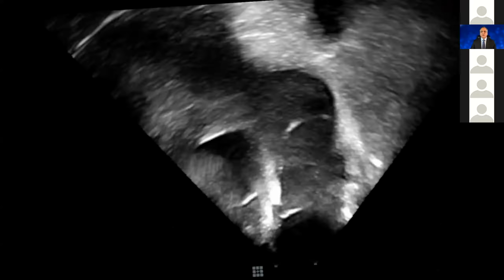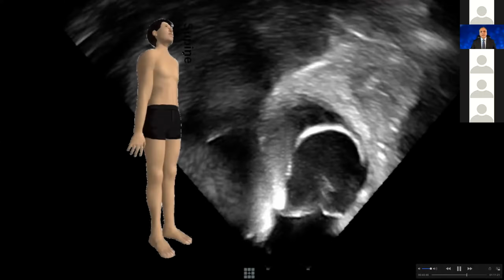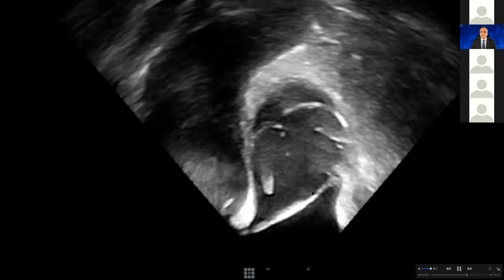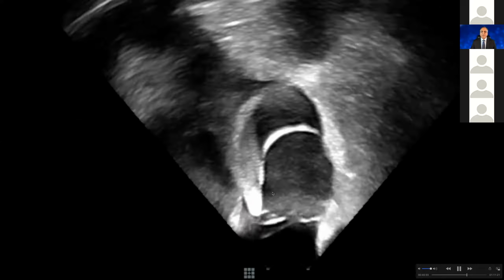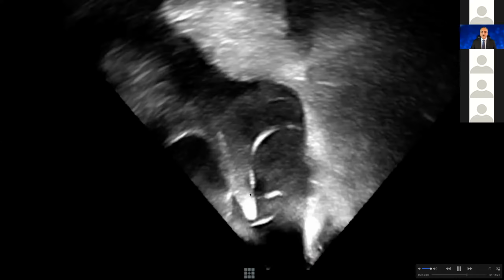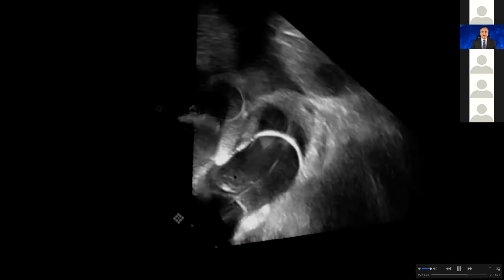And you can also do the upside down, and now you can see a real view that head is this way. It is like a pediatric kind of echo, and the feet is this way, and you can see that RVOT, and this is a pulmonic valve, and this is my ablation catheter, a candy cane coming right above the pulmonary valve. Have a very good contact.